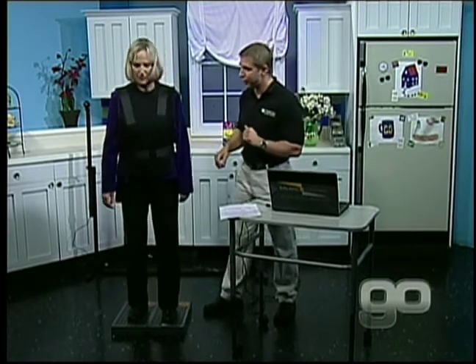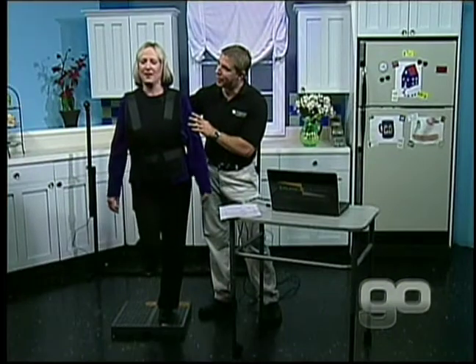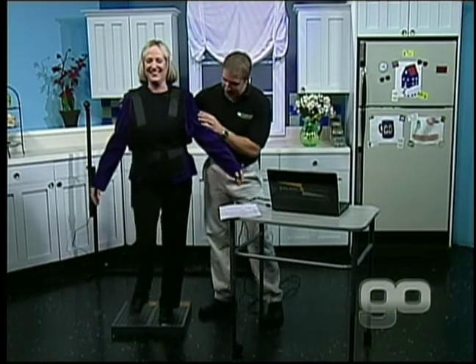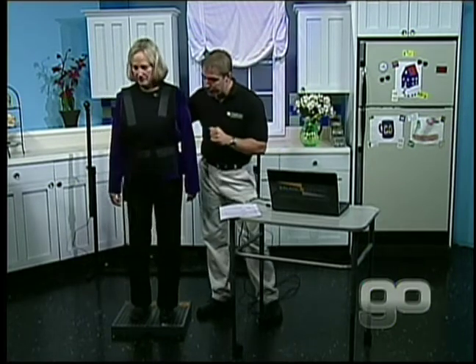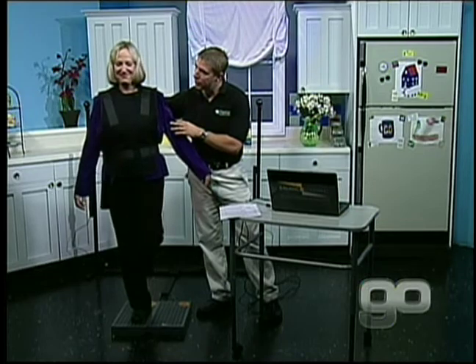I need you to close your eyes. Uh-oh. Yes. Okay. Go ahead and stand on your left foot. Oh, on my left foot even. 5, 4, 3, 2, 1, and relax. Very nice. How did that feel? A little less steady, right? A little bit off, yeah. Vision is a very critical component of balance, and we'll cover some of that a little bit later, hopefully, if we have time. Okay. Now stand on your right foot, please, and close your eyes. 5, 4, 3, 2, 1, and relax.